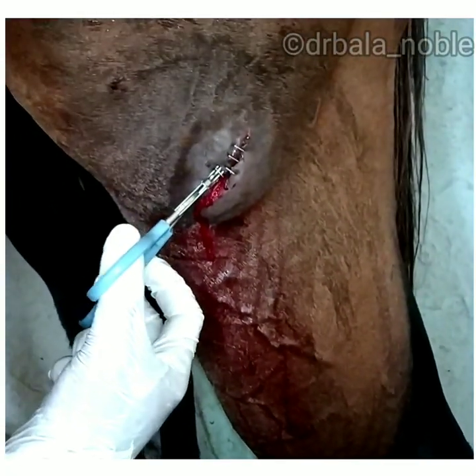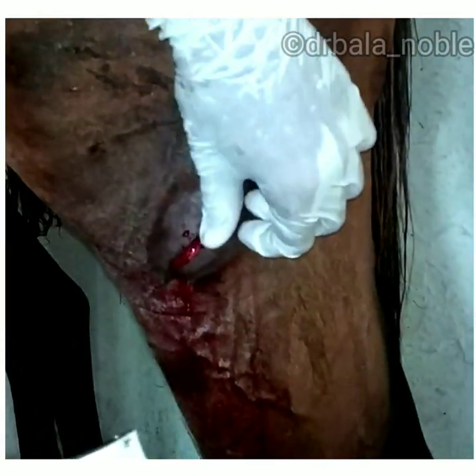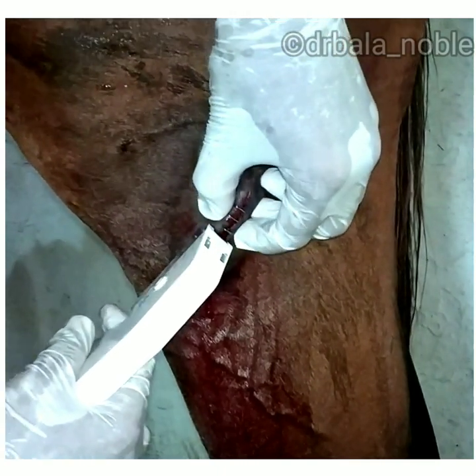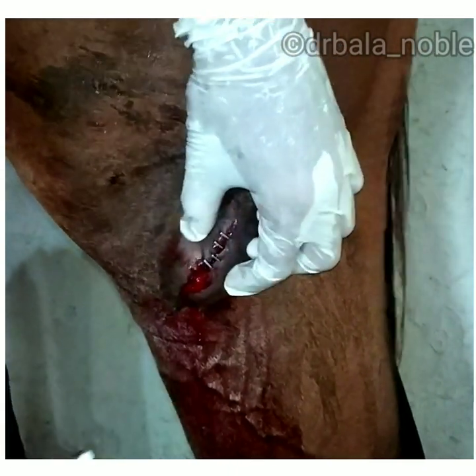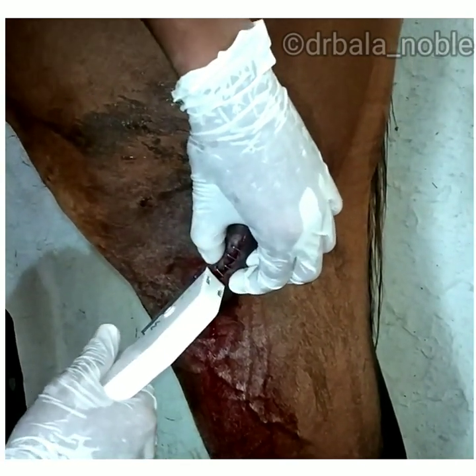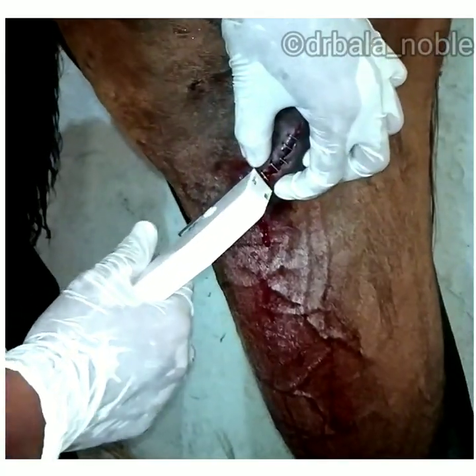We can apply the staples 0.5 to 1 centimeter apart based on the location. This skin stapler is indicated in linear laceration through the dermis that have straight and sharp edges.